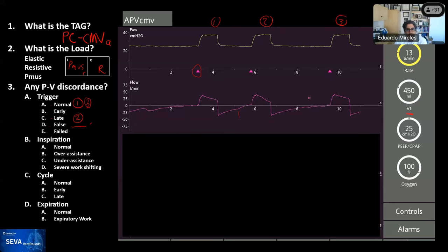During inspiration, there's evidence of some patient work, but no major discrepancy in tidal volume, so this is probably close to normal. In terms of cycle: there's no increasing pressure, no pause at the end, so it's not late cycle. There's also no amputation of effort, so not early cycle either — this looks relatively normal. We also noted some expiratory work on breath number two.